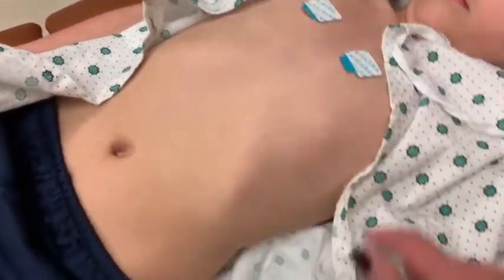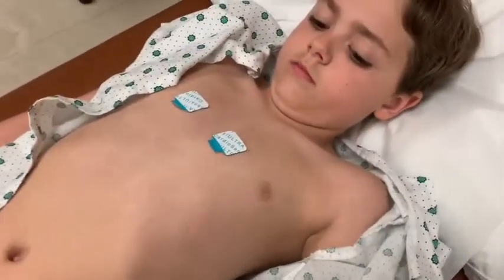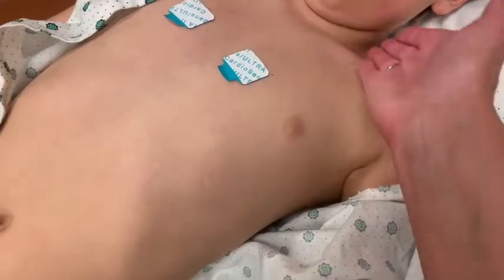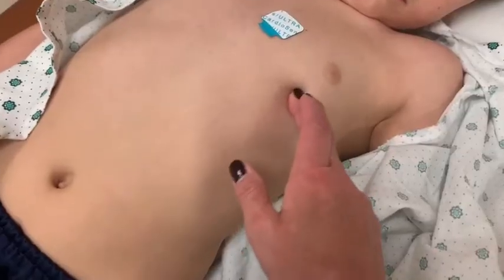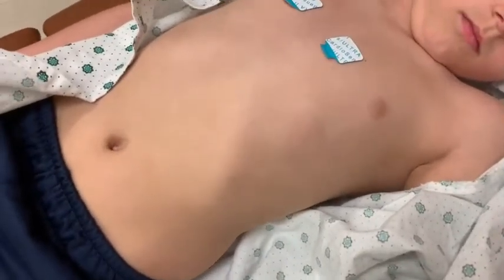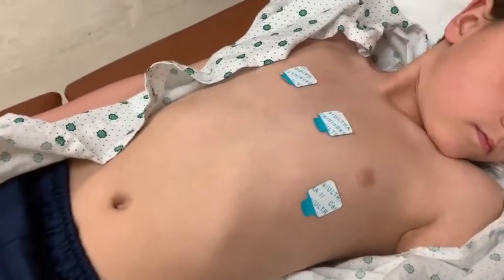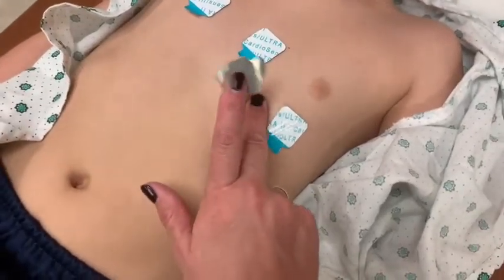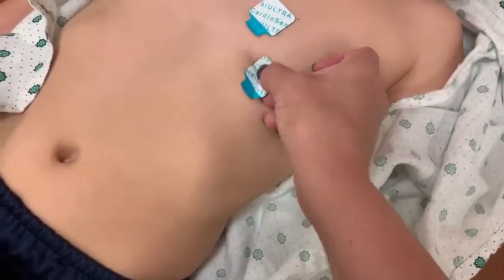So I did V1 and V2. Like in the lecture I'm going to skip V3 to find V4 first. Here's Colton's clavicle right here. We're going to go midway between that clavicle and straight down. On him it's going to be nipple line — fifth intercostal space, mid-clavicle. So then we're going to put this lead right here. Then we're going to go ahead and do V3, which is going to be midway between V2 and V4 in that fifth intercostal space. You can see me right in that intercostal space right there, so we put this one right here.